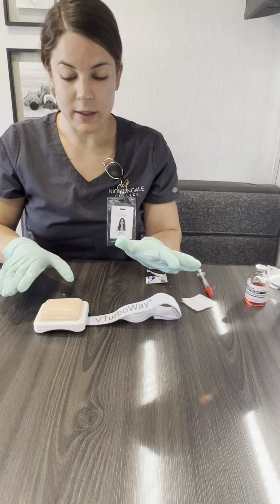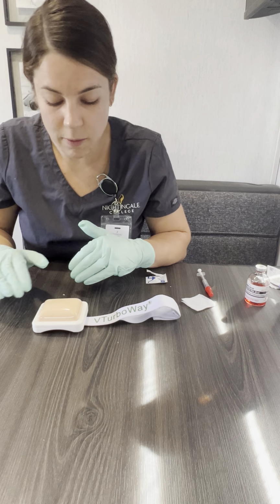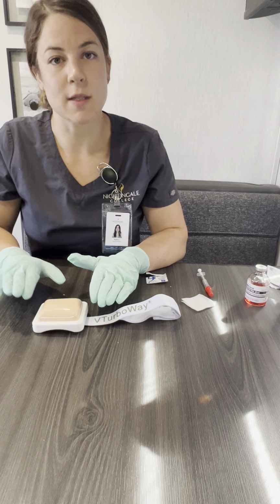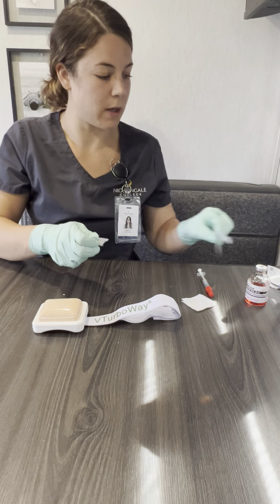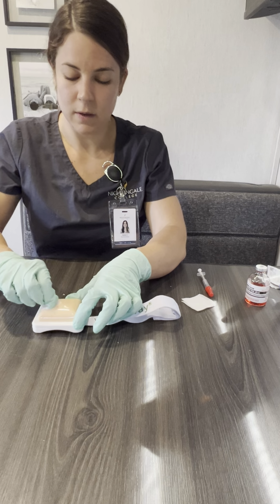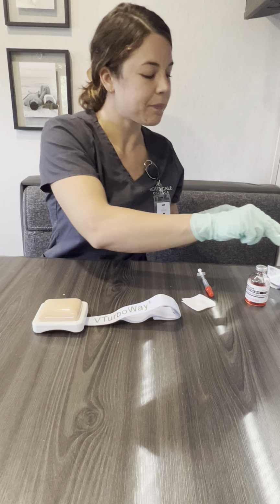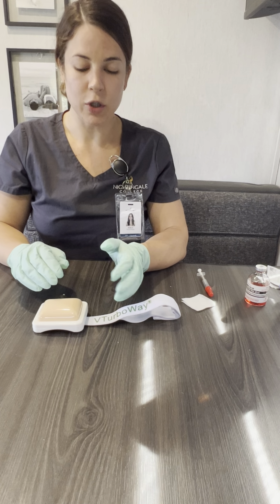So this part of the skin on the forearm is where I'm going to be looking. Before I get started with this patient, I'm going to go ahead and check and make sure there's no cuts, redness, swelling, bruising on the skin, making sure that this is a good spot. Once I have done that, I'm going to go ahead and clean it with an alcohol swab. After I've cleaned it with the alcohol swab, I'm going to let it air dry for just a little bit till the skin is clean and dry.